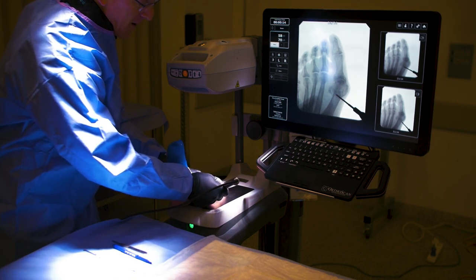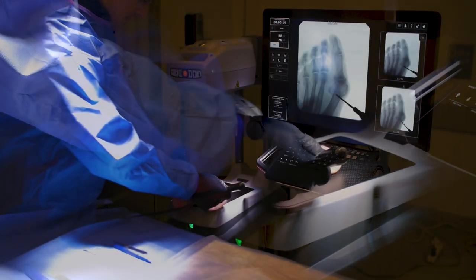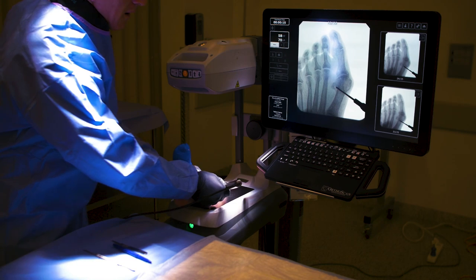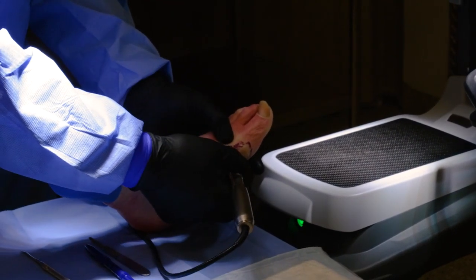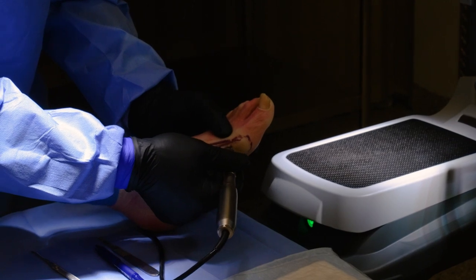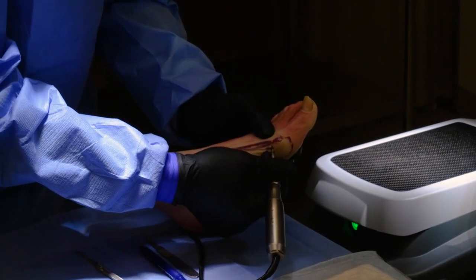Now I'm using my fingers to feel. In the real world I'll be operating like this so my fingers will feel as I come through the bone, but for purposes of the lab we'll use the fluoro machine. I'm feeling, I'm hearing — I'm through. I don't want to be through too far otherwise I won't have the cutting flutes in the bone. I'll be holding with my fingers in real practice. You can hear and feel; I pivot at the skin level so I'm not burning the skin — I push up at the same time and I take my time. There's absolutely no rush here.